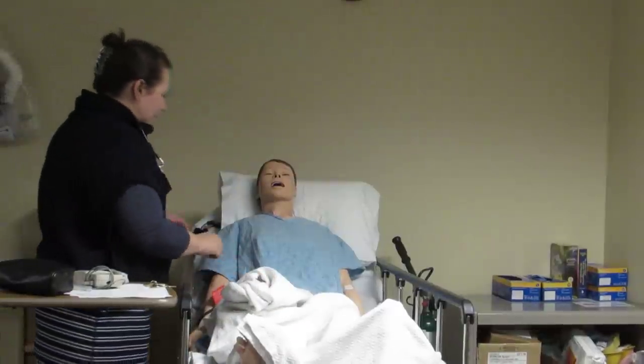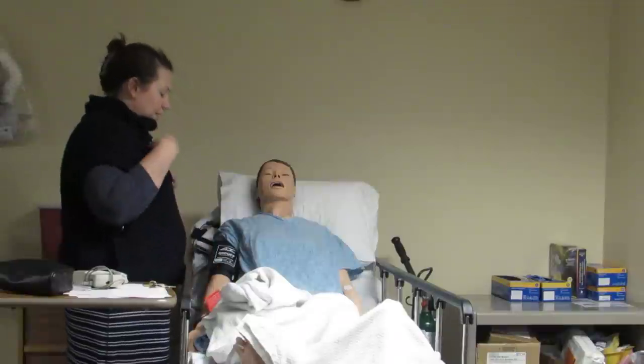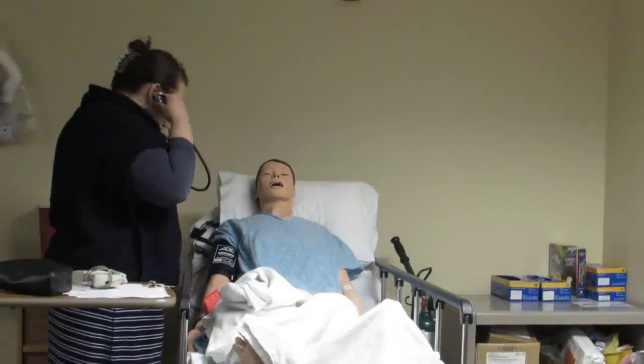All right, Mrs. Smith, so I'm going to take your blood pressure first. My simulation mannequin here already has her cuff on. So I'm going to go through and take her blood pressure.